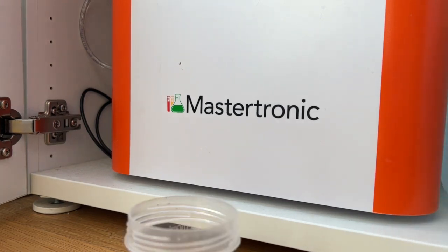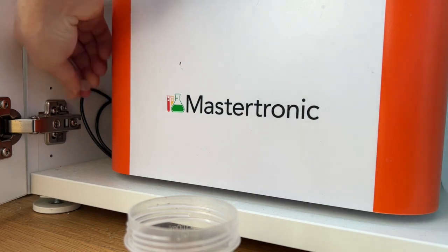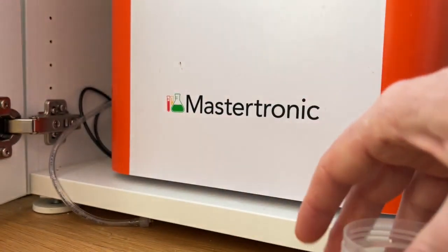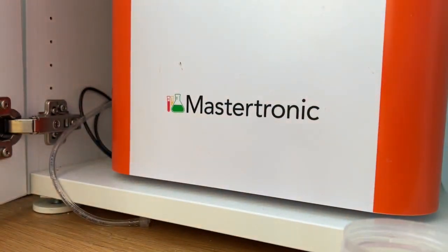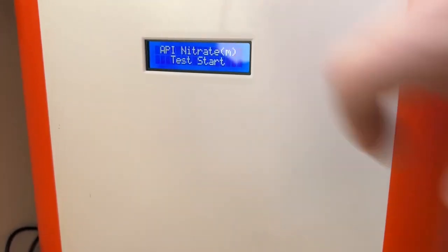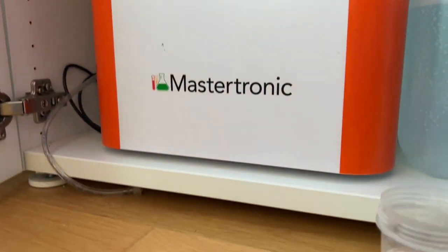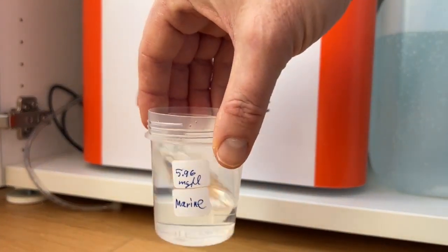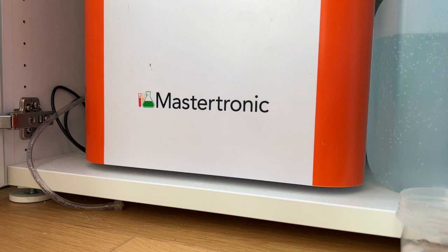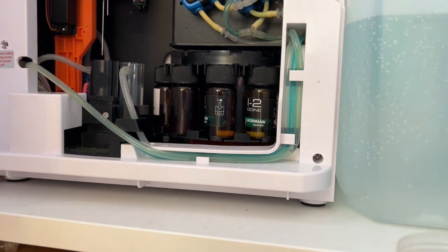Before you start the script from the app, remove the inlet hose — the sample water hose. Remove that. Now start the measurement script. Here is the marine script started: the API nitrate reagent script, with M indicating marine mode. I choose it here because I have a marine-based reference fluid. Now you hear the stepper starting — that is the first action.